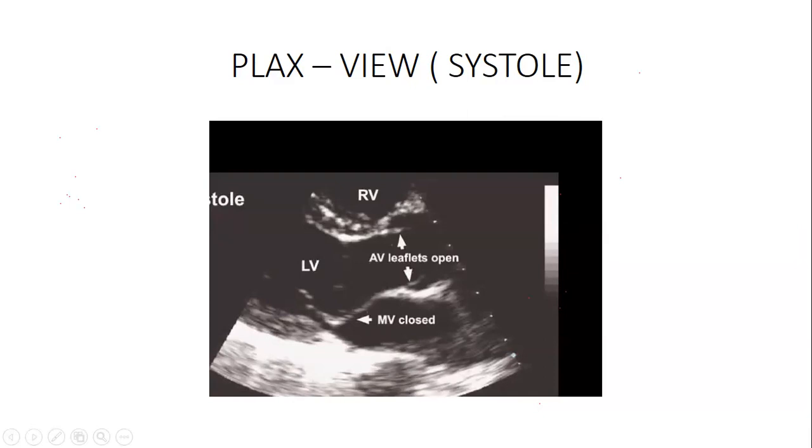And remember, when the myocardium is in systole, the myocardial muscles thicken. Get this point? This is a physiological explanation. They thicken. And during relaxation, or diastole, the heart muscles thin. That's why you should not make the mistake of quantifying LVH or measuring the septum when the heart is in systole. Those are wrong measurements.